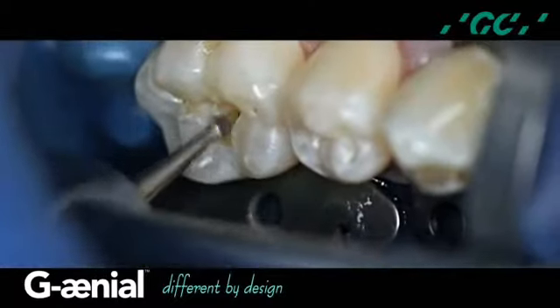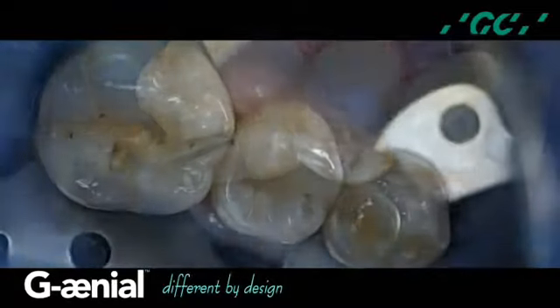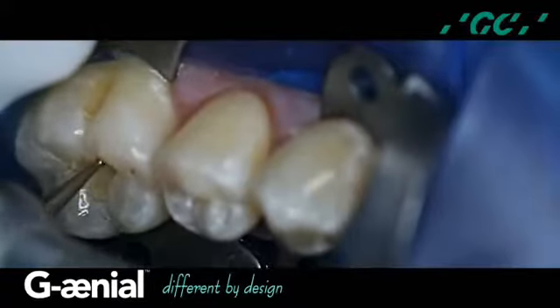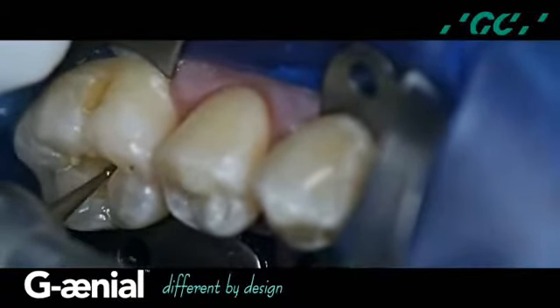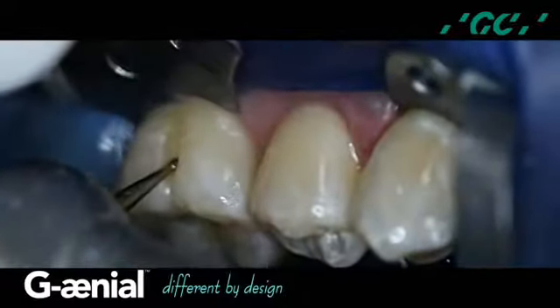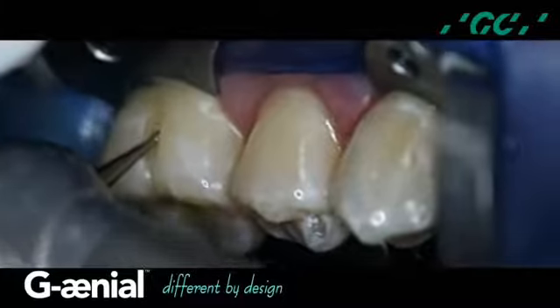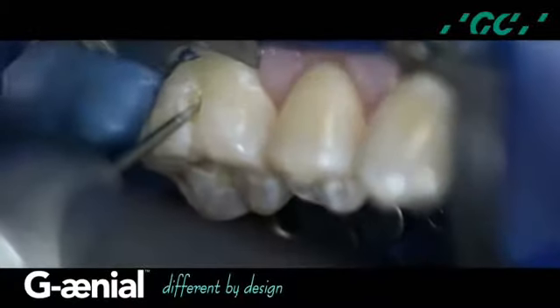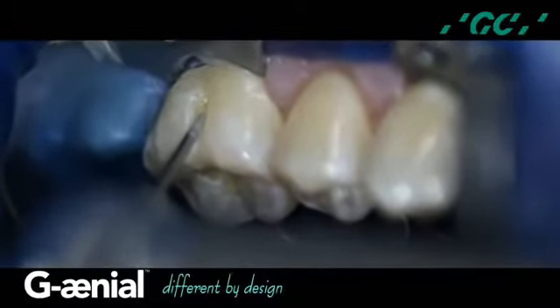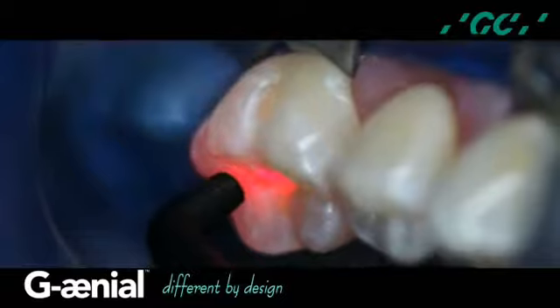The carious dentin is removed with the number 4 slow-speed carbide round burr by Brasser and visually re-examined. This process is continued until all the destructive demineralized process is eliminated. The composite restoration is removed with a number 2 high-speed round burr using a water spray. A bevel is placed on the buccal preparation to integrate and disguise the composite restoration, but not on the occlusal. And a final caries reassessment.